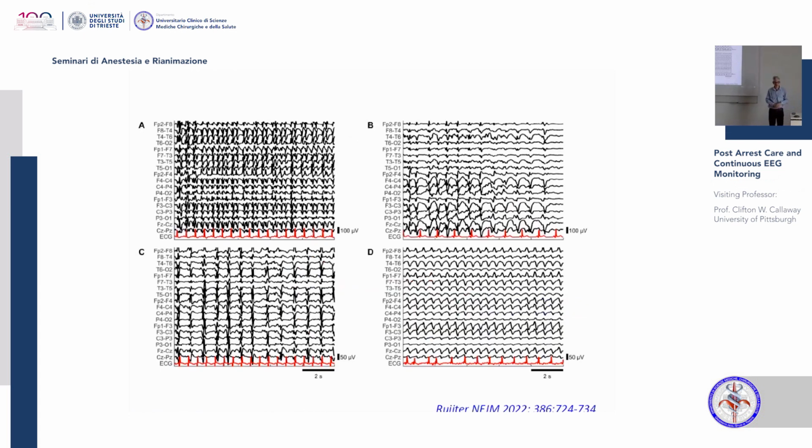They show us pictures of what they're talking about. And these are the tracings of patients with these rhythmic patterns. The time scale there is more compressed than the one I showed you on my tracings. And you can see that those are those epileptiform discharges at pretty high frequency, sometimes with background, sometimes with no background. So these are the patients that we're talking about, and they resemble my patients that I care for.